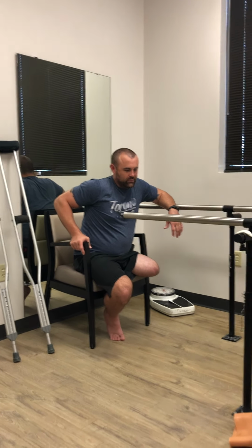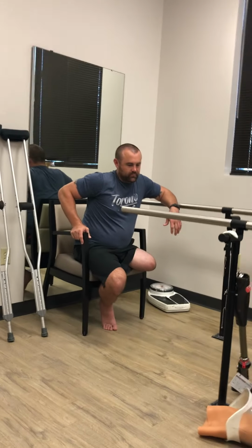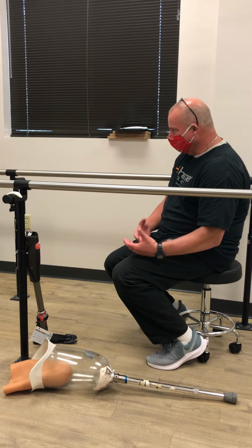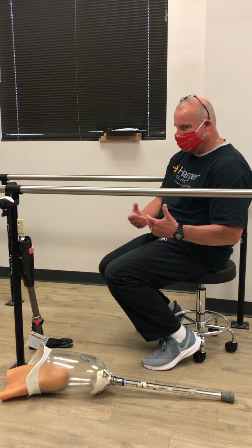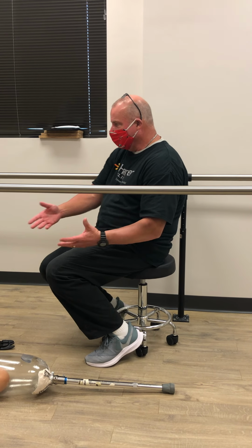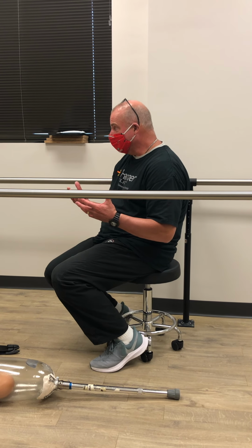Yeah. I get it. Honestly, the biggest thing you're gonna run into when you get out of the gate is just getting used to having it on, which is the first thing for everybody. My goal is that you wake up in the morning, you put your leg on. It's your leg.